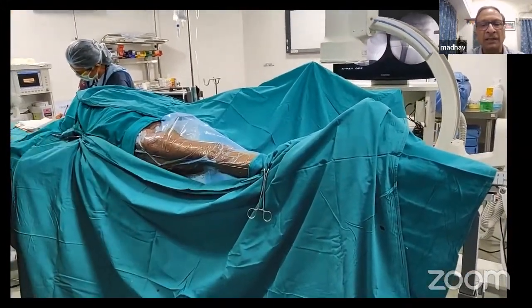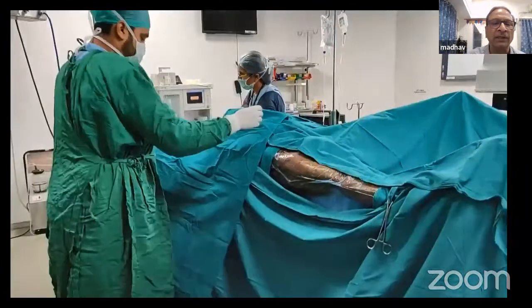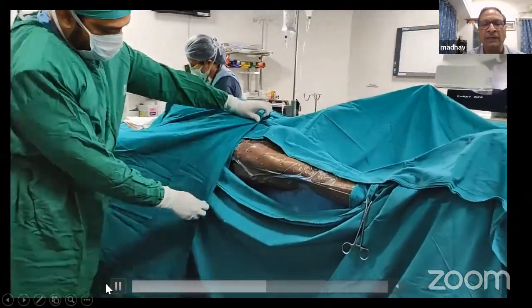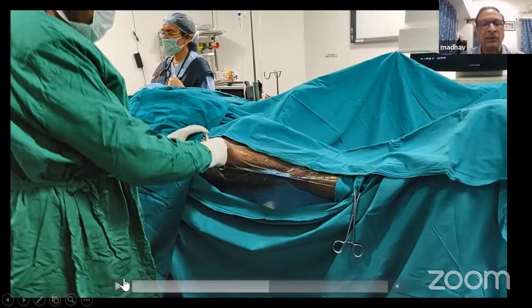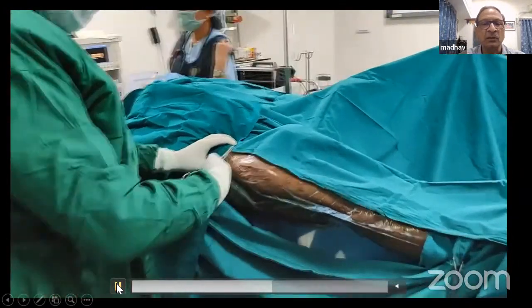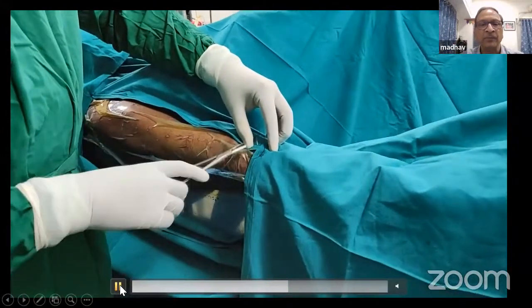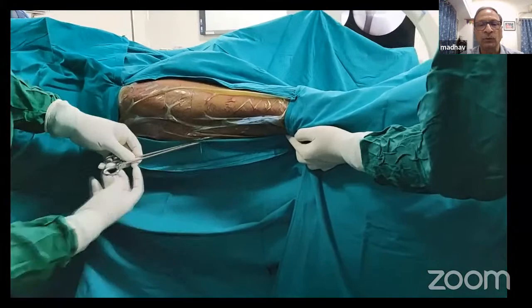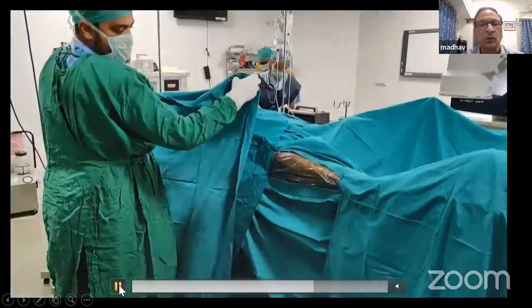Now, on the lateral side of the limb to be operated, you put a big sheet, and then suture these ends. These are stitches being taken to secure these big sheets which have come from all sides: one from above, one on the opposite limb, and one on this side. All of them are secured in place by ethylon stitches which you take through the sheet and superficially through the skin, so that they don't move or come out. As you can see, all the sheets have been secured.